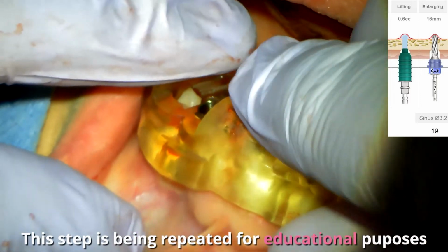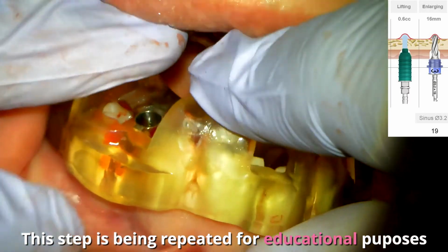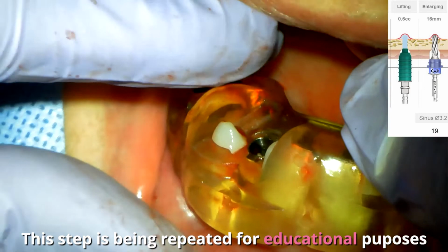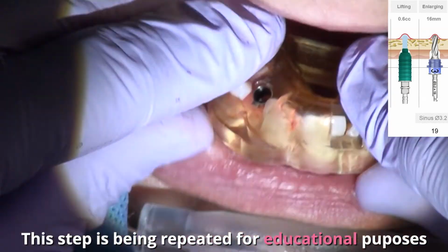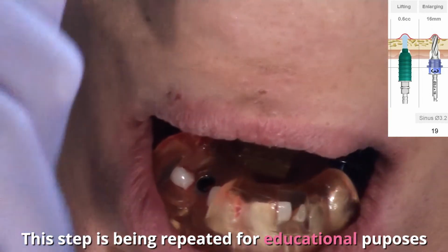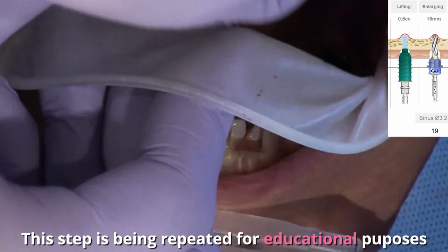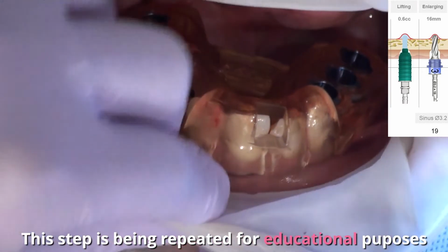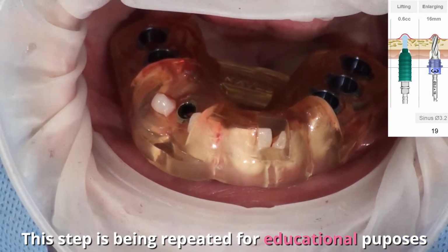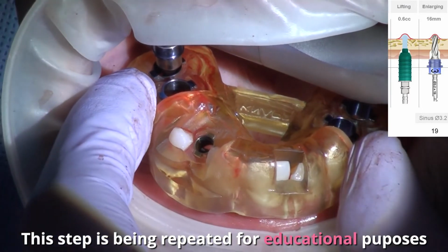I'd like for you to see that water movement a little bit more. So I'm going to try to do something clever here. I'm going to get the guide back in place. Beautiful. I'm going to use this next drill, and then I'm going to do the sinus hydrostatic lift one more time, just because I want you to see that. So I'm going to go up to the 19 drill, which is the next drill in the protocol, with the 3 stopper. And with the 3 stopper, this is going to push an extra millimeter down into the sinus.